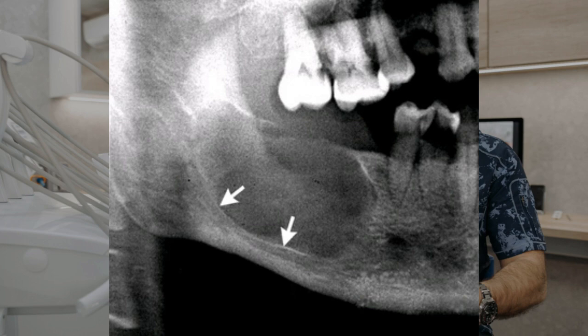The epicenter of a residual cyst is located in the former periapical region of the involved or missing tooth and in the mandible. It is always superior to the inferior alveolar canal. In this picture, the epicenter of this residual cyst is located superior to the inferior alveolar canal. It has displaced the canal in an inferior direction. Note that the cortical boundary is not continuous around the entire cyst.